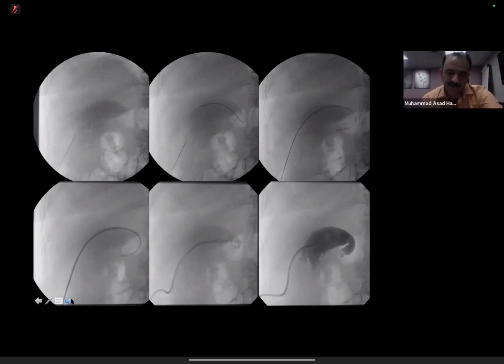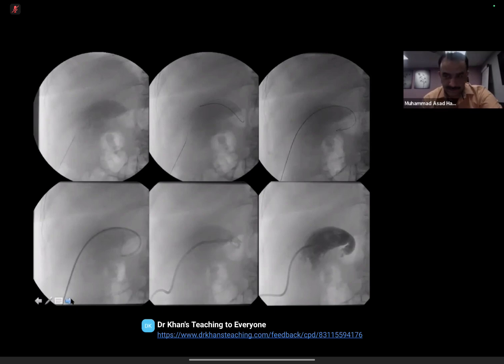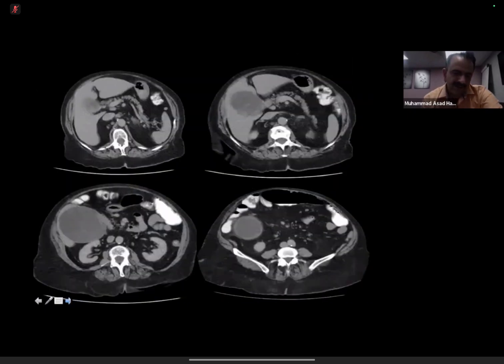With cholecystostomy, there used to be a discussion whether one should be going through the liver or not. Okay. But there are studies now published that one doesn't need to go through the liver parenchyma. For the safety of the procedure, it is still recommended that you go through the liver parenchyma if available.